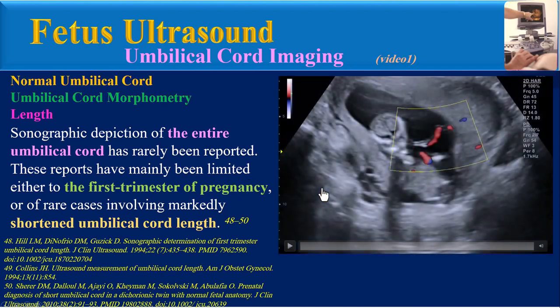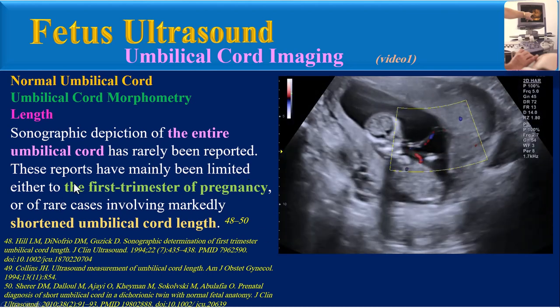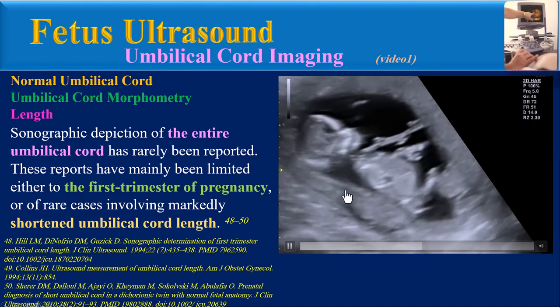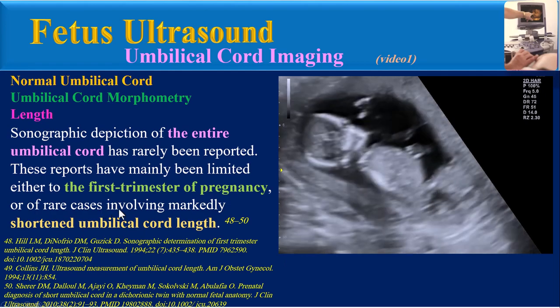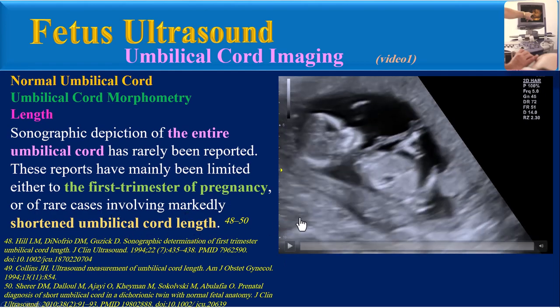Sonographic depiction of the entire umbilical cord has rarely been reported. These reports have mainly been limited either to the first trimester of pregnancy or to rare cases involving markedly shortened umbilical cord lengths.